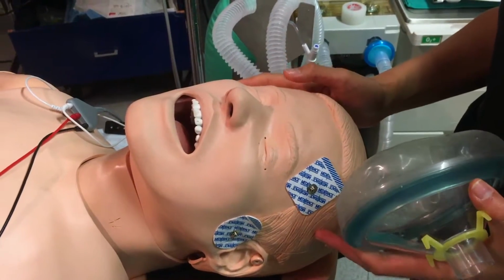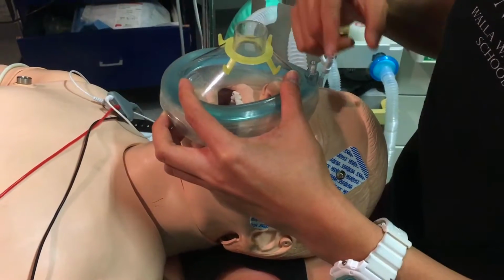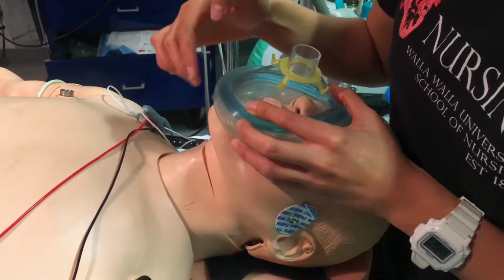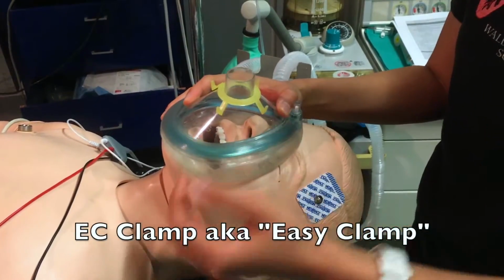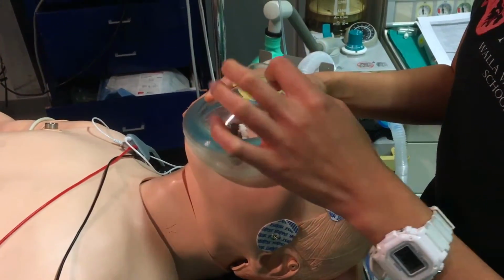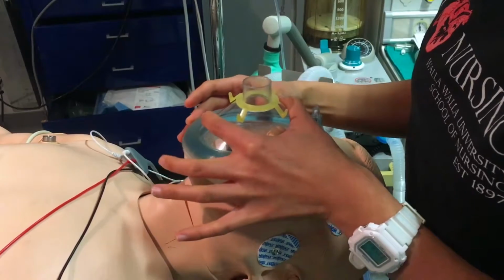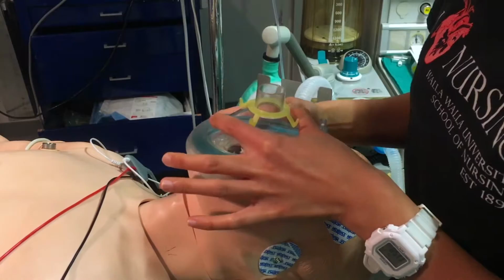When masking a patient, you want to make sure you place the face mask appropriately. The top part should be aligned with the pupils. The side should be by the nasolabial folds, and the bottom part of the mask should be between the lower lip and the chin. So they use a technique called the EC clamp. Basically, you make a C. The C part is your thumb and your index finger, and the E part is the last 3 fingers. You want to put your thumb on the top part of the mask and your index finger on the bottom to do counter pressure to keep the mask on the patient's face.